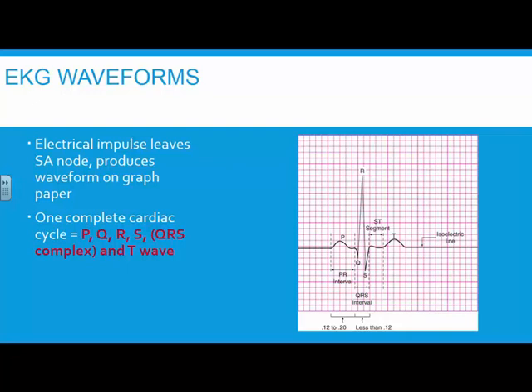Now, one of the things that we know that the ECG monitoring does is it tells us the electrical function of the heart, right? We know that it won't tell us the mechanical function. We have to do our own assessment. We have to check all the mechanical functions. But it will give us an electrical assessment of the heart. And every point on that ECG strip, that complex, gives us an indication of something going on in a particular area of the heart. The roadmap. Okay?